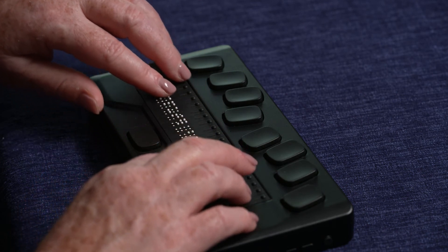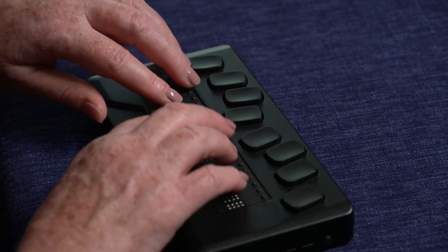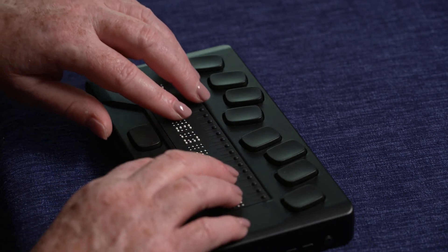Use the down thumb key to move through the list until you see the network you want and press Enter. You will be prompted for the network password. This password should be entered in uncontracted, unified English Braille.